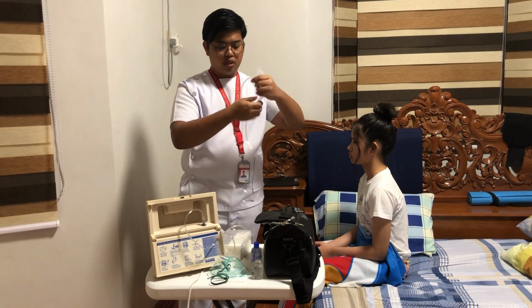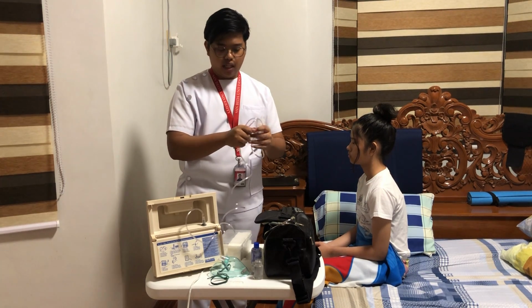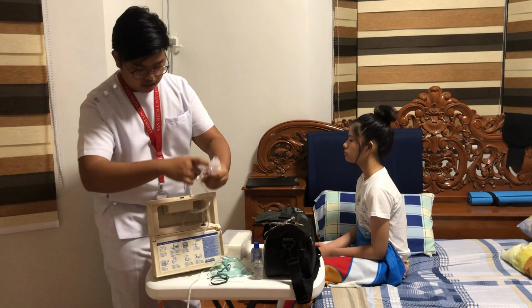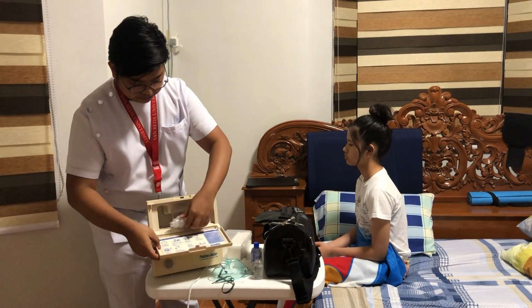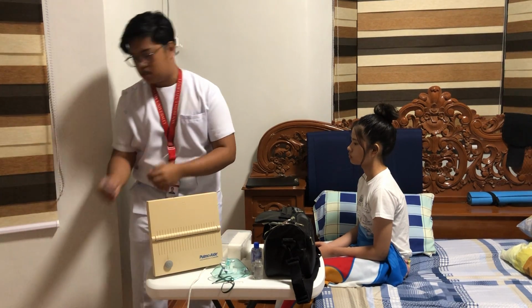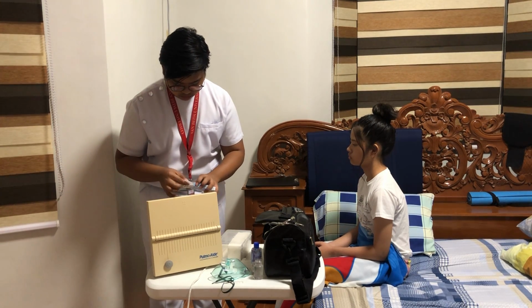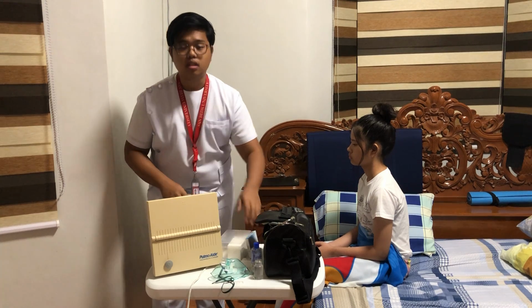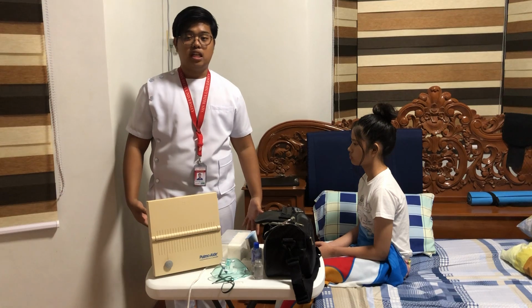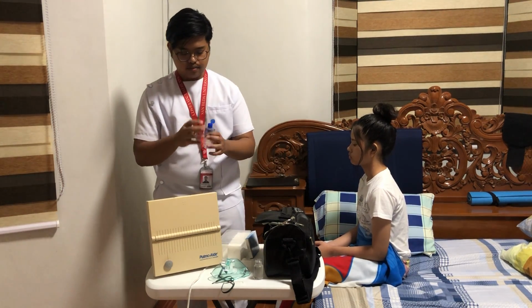And then after doing so, we're going to dispose of all of the waste appropriately, since we have our trash bin here on our side. So dispose. And then after disposing, we need to remove and discard our personal protective equipment. And then again, we need to perform hand hygiene.